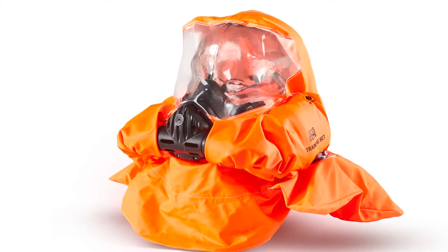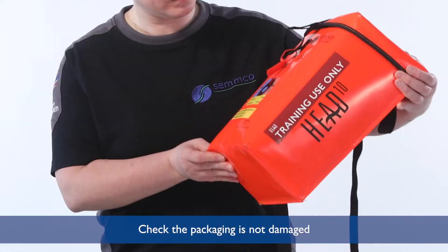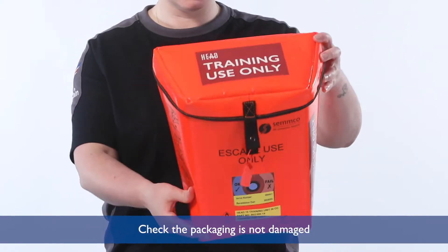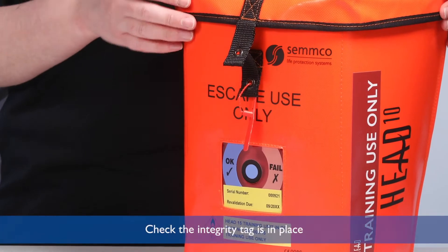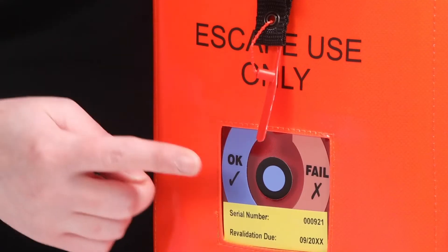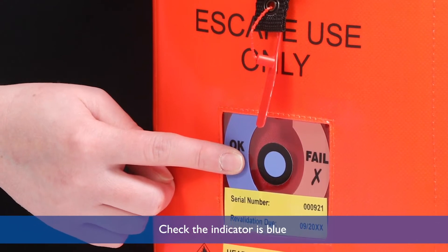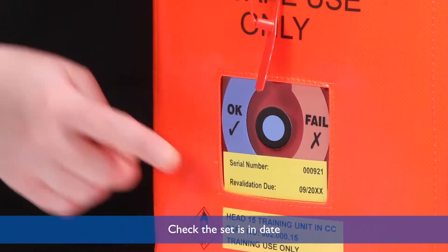Before donning, check the packaging is not damaged. Check the integrity tag is in place, check the indicator is blue, and check the set is in date.